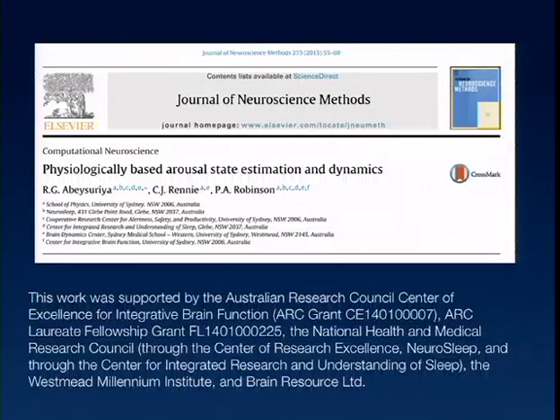That's right. So to answer your questions in reverse order, the novel development in this work is the tracking routine that lets us infer the brain state in real time. And in particular, our advance is in incorporating temporal continuity, which stops our fitted trajectory from bouncing around too much in the parameter space, because it's a very high-dimensional parameter space, and it's possible that you could have multiple local minima or multiple acceptable fits.